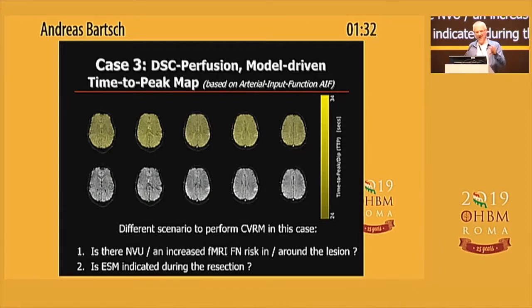And this is a case where you can have a hard time with ICA, and you need to think how to do a good ICA on it. But I found some ways, and even with ICA, I didn't see any evidence that the perfusion is abnormal in the tumor.